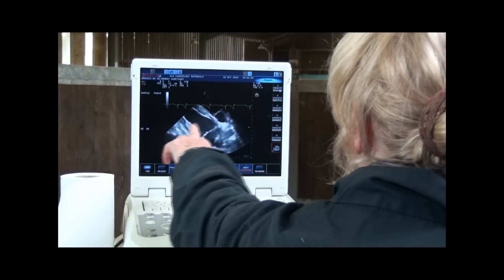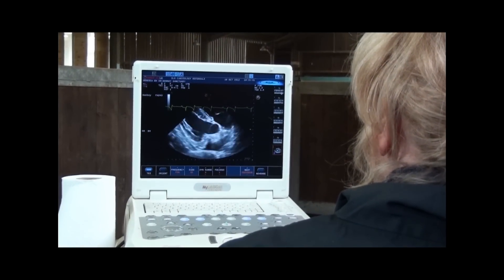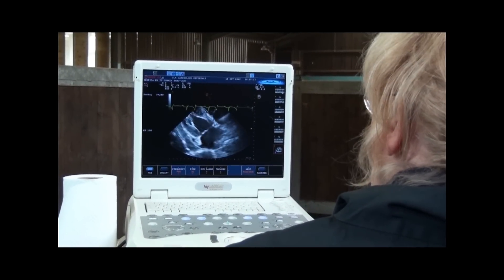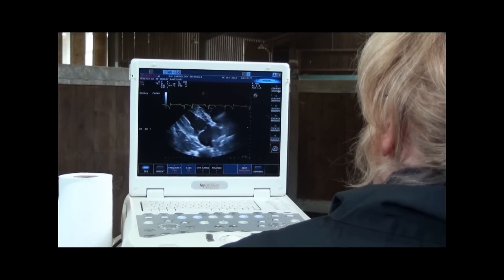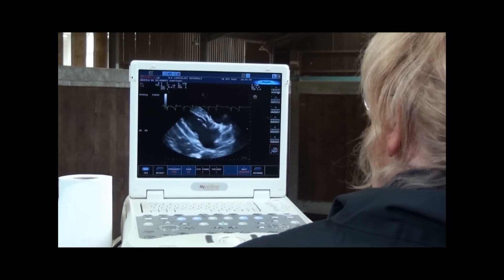What we're looking at here is the main pumping chamber — the left ventricle. That's the most powerful chamber in the heart, which pushes blood into this huge artery called the aorta.